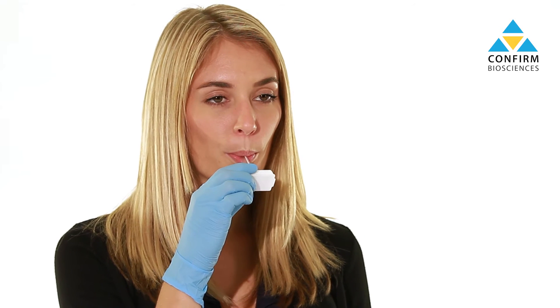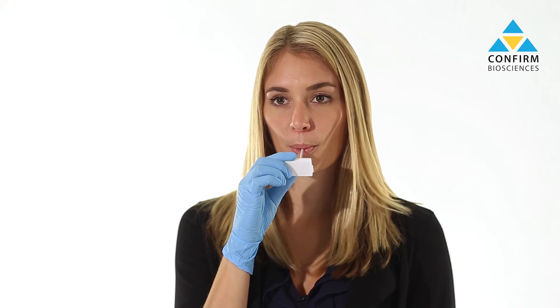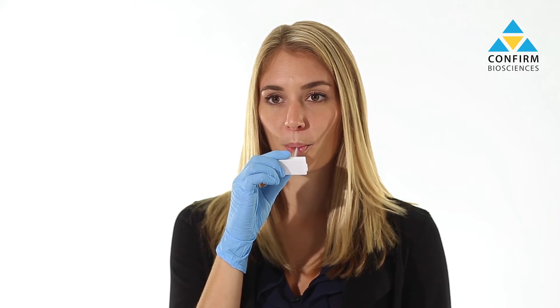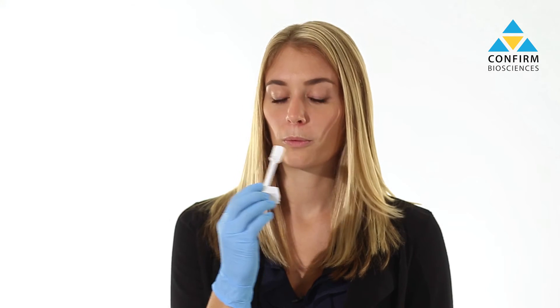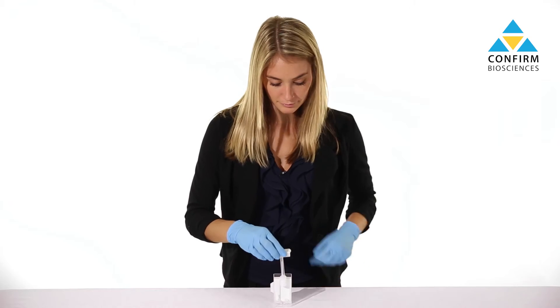Begin by inserting the sponge end of the collection stick into the donor's mouth and soak the sponge for three minutes, or until the saliva indicator shows it has become fully saturated. Then remove the collection stick and vertically place it into the testing device.